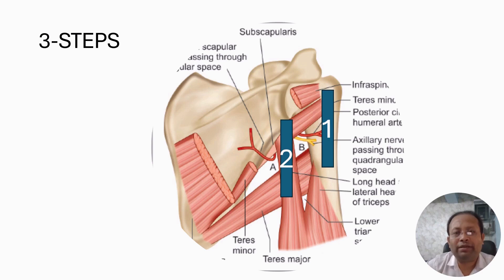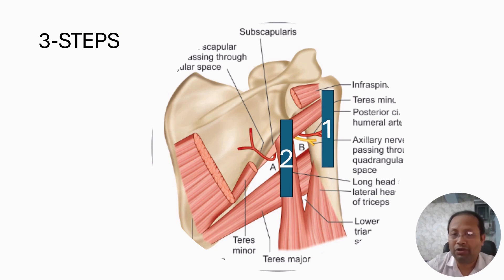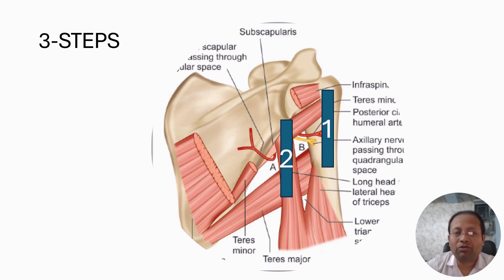We shall locate the quadrangular space in three steps. In Step 1, we put the linear probe in a long axis view of the upper part of the humerus, so a partial picture of the head of humerus, the neck, and also a part of the shaft will be visualized under ultrasound.